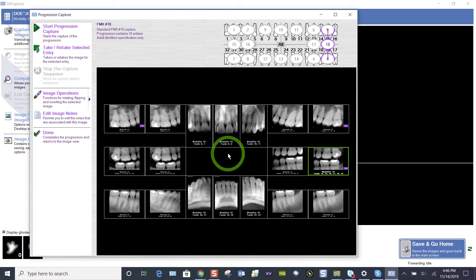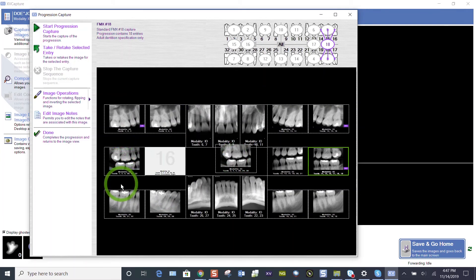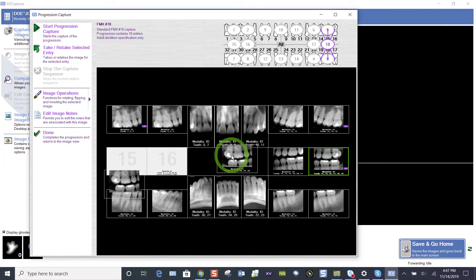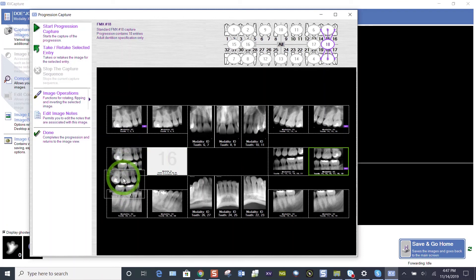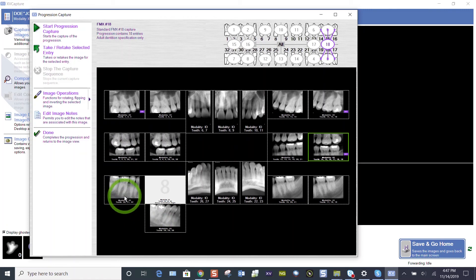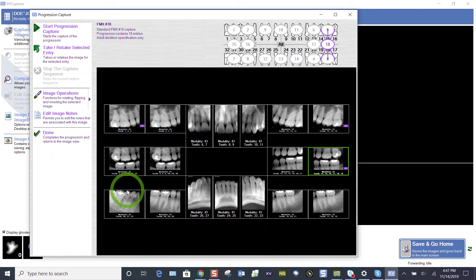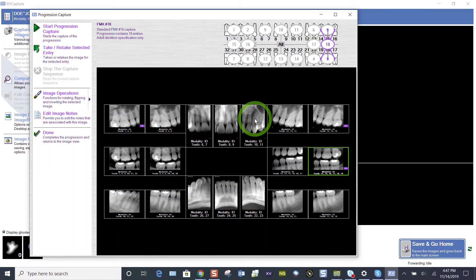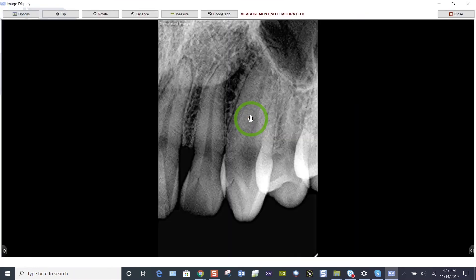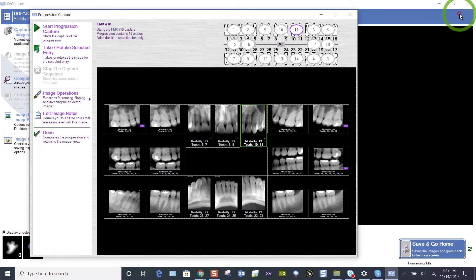The other great thing here is if I needed to flip any of these, I can use this black border and let those images hang out while I drag and drop them where they need to be. If this image really belongs here and that image belongs there, I can just left hold and quickly and easily rearrange them. If I see something on an image that I want to look at in a little bit closer mode, just double click and we'll open up that image to the enhancement screen. I can quickly close out of that with the close in the upper right hand corner.